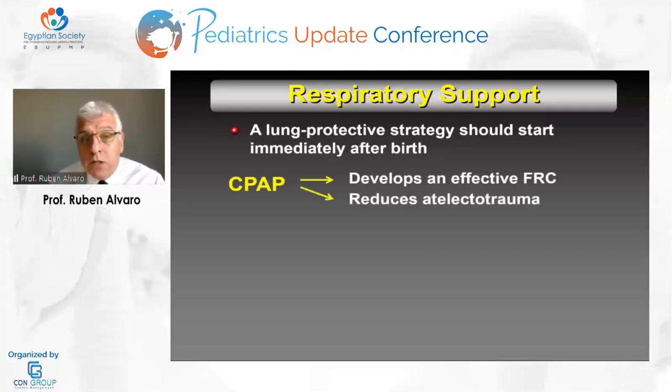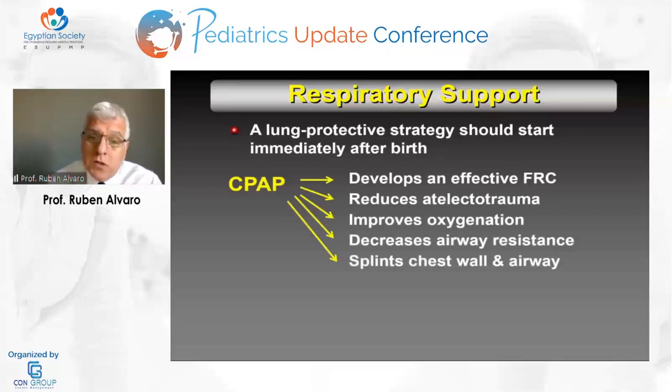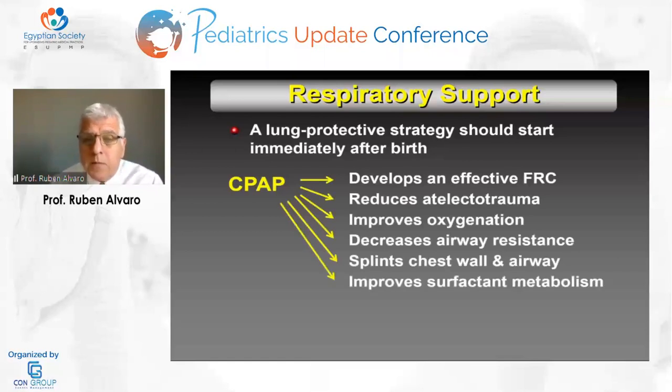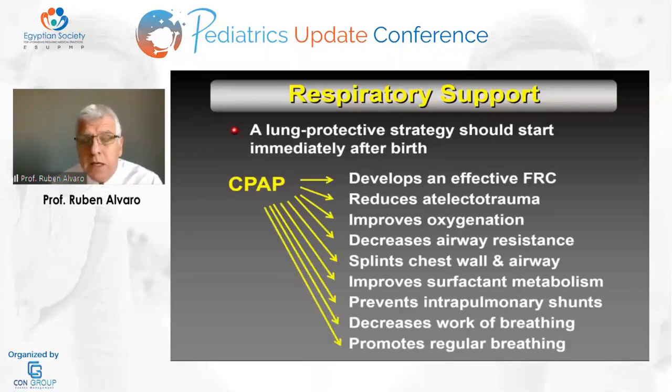Also, we know that it reduces atelectrauma, improves oxygenation, decreases airway resistance, helps us to splint the chest wall and airway, improves surfactant metabolism, prevents intrapulmonary shunts, decreases work of breathing, and finally, we know that nasal CPAP promotes regular breathing.